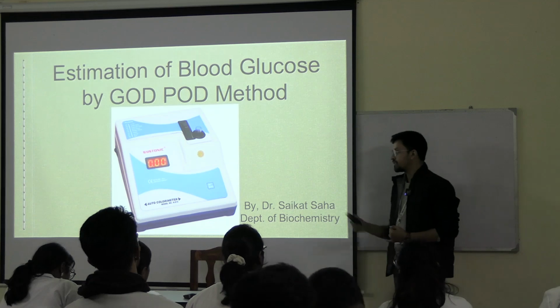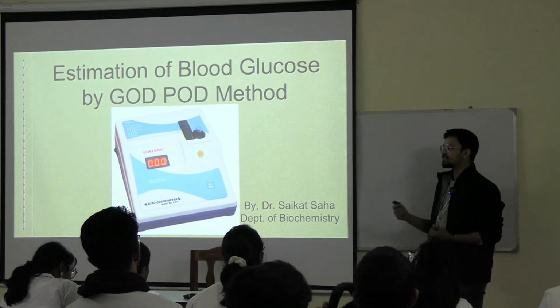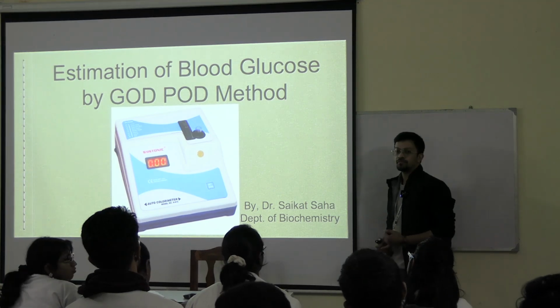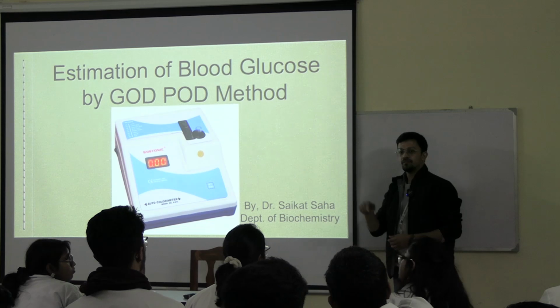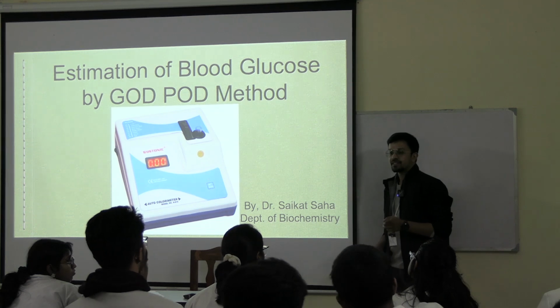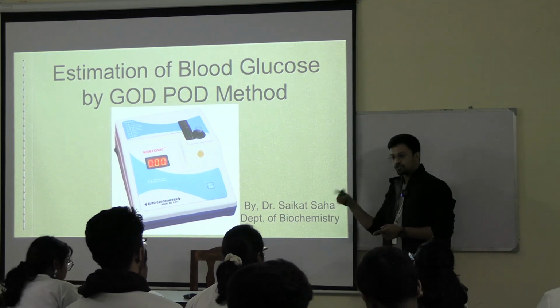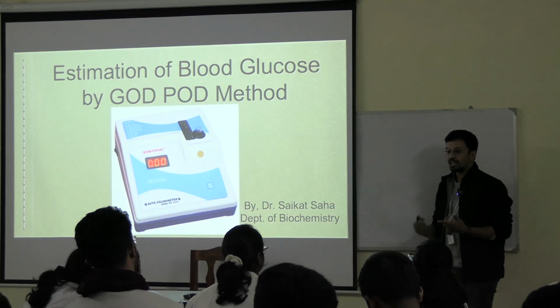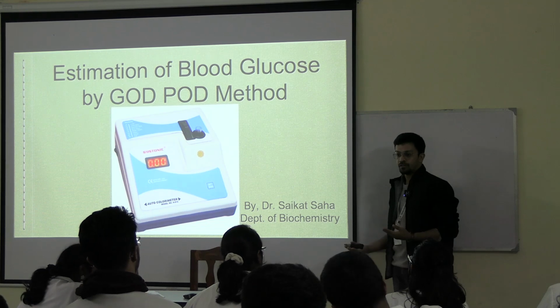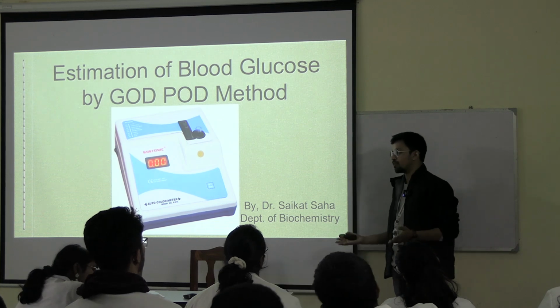That is by colorimetry. This instrument you have already worked on, so you know it, this is the colorimeter, and we use the same principle, the same Beer-Lambert law. Everybody remembers Beer-Lambert law? Somebody tell me what is the law? Absorption is? Beer's law is absorbance directly proportional to C, where C is concentration, and L is length, that is also directly proportional. Over here the length is fixed, so your absorption is directly proportional to the concentration. More the concentration, more will be the absorption. So this test also depends on the same principle.